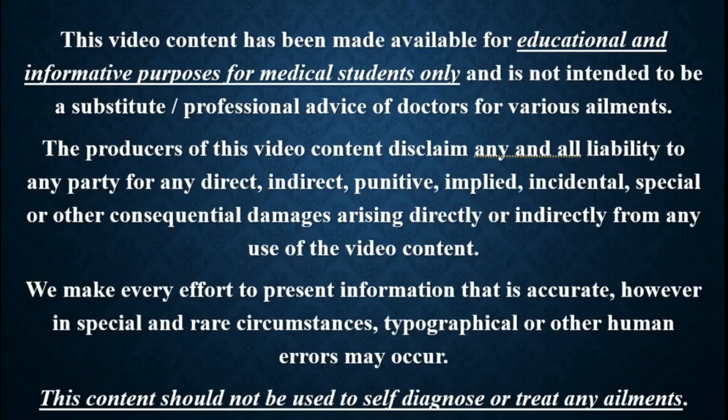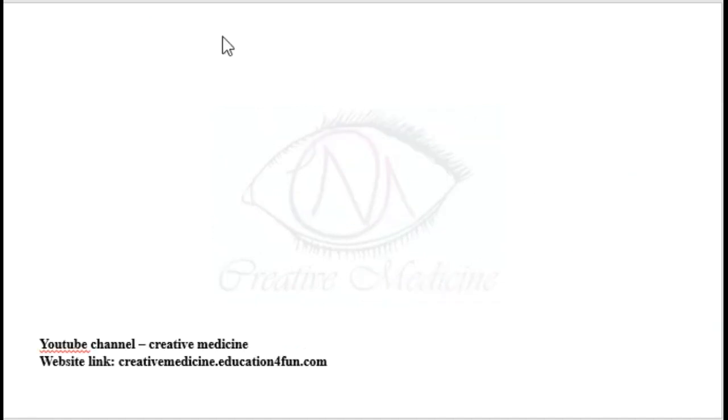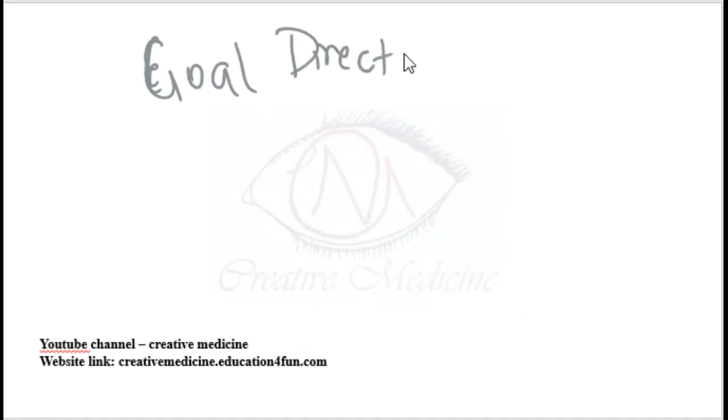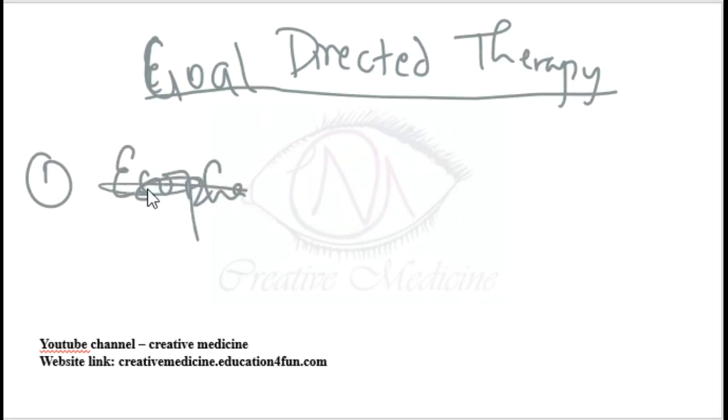In this lecture, we will learn about Esophageal Doppler monitoring. First, goal-directed therapy. In goal-directed therapy, we have to see for three different issues. First, you will have to check for hypovolemia. For checking hypovolemia, you can do esophageal Doppler monitoring.